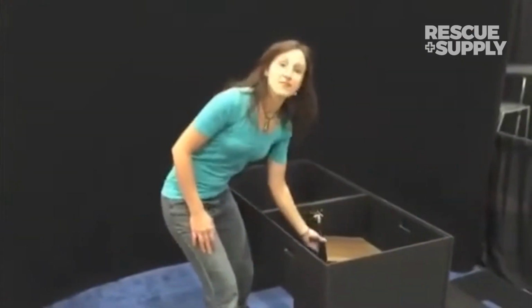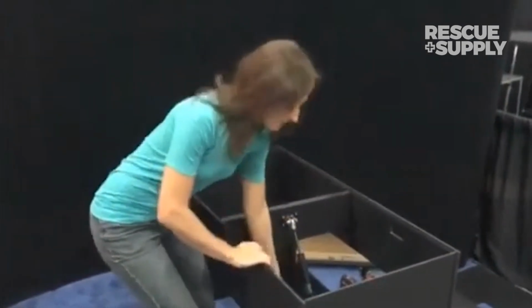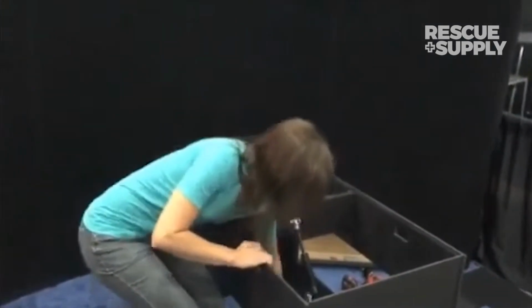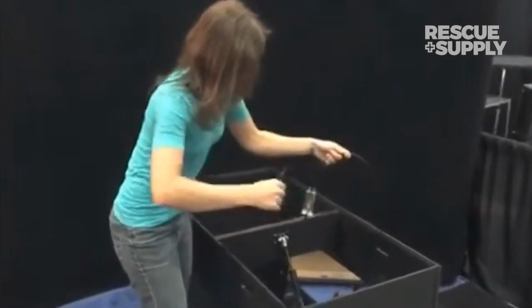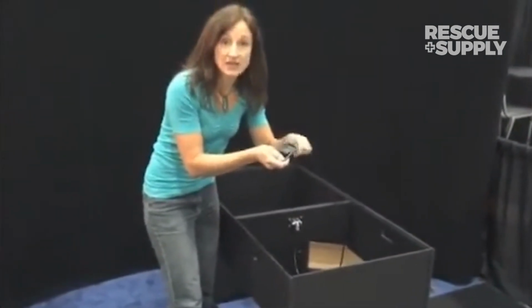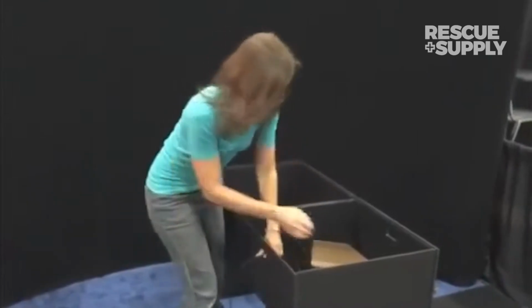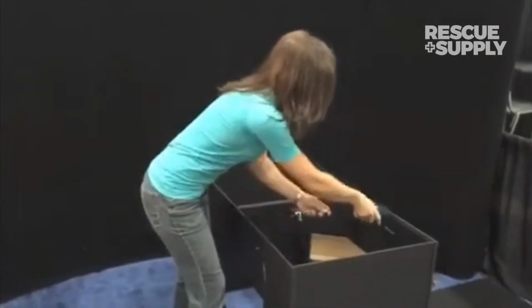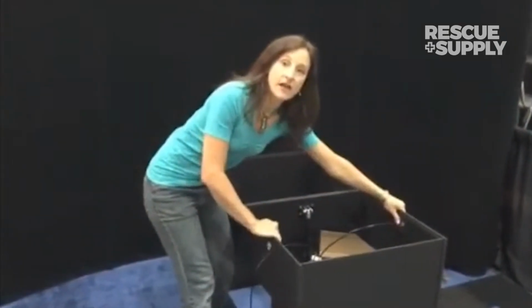Alright, at this point it's important to note that the lift mechanism arm needs to be facing the side of the table for the lift handle openings. So the lift handles that are attached to the cable can be pulled through either side of the lift handle openings.